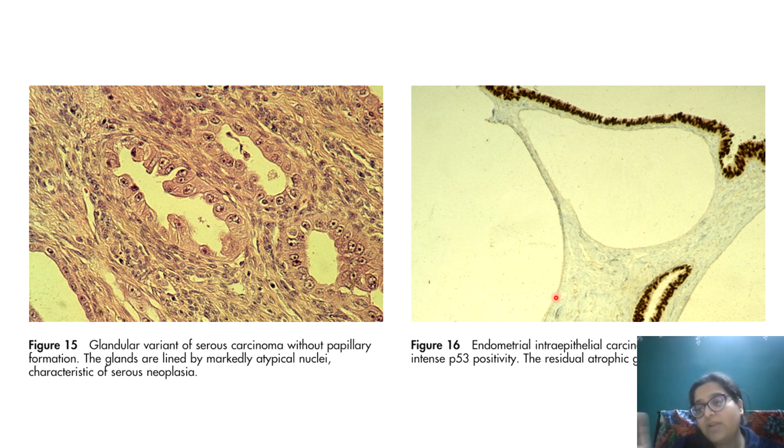Not all cells can be in the dividing phase at one point of time. That is why P16 and P53 are heterogeneous. But when mutated, they can be completely lost or very strong, meaning all cells are in the same phase, which is not possible in a normal body.